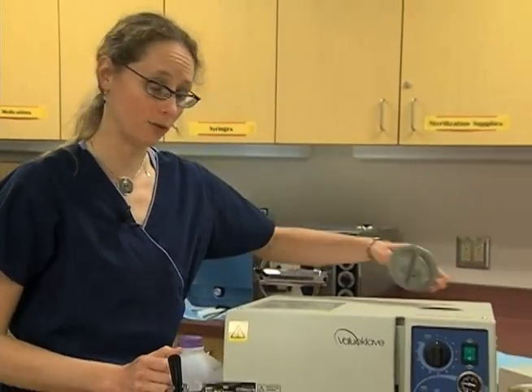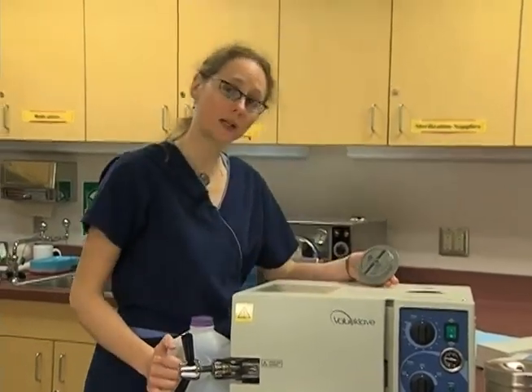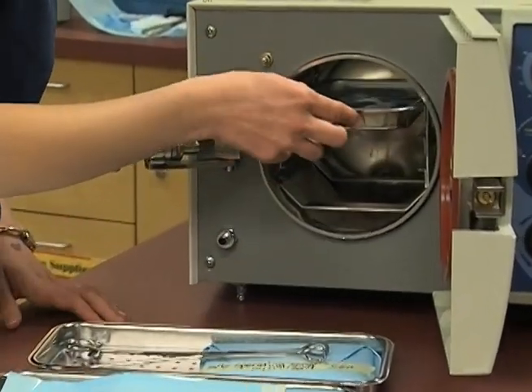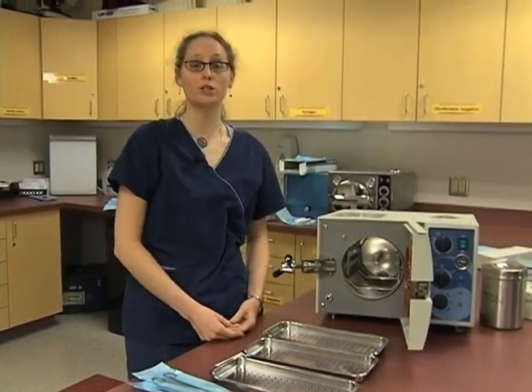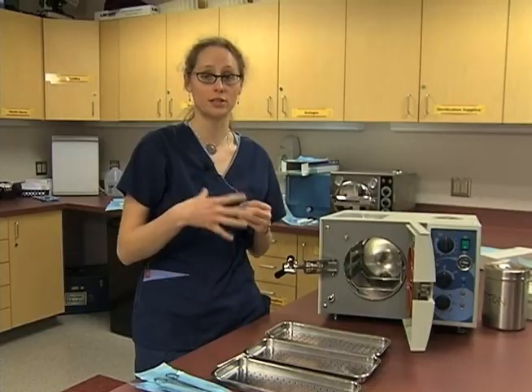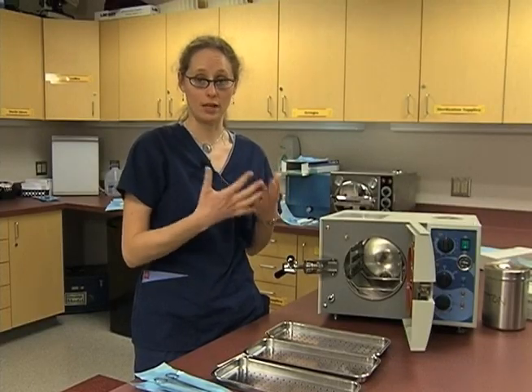Each time we go to use an autoclave, we want to check the water level and make sure that there's plenty of water in there. Once we know there's enough water, we're going to load our autoclave. Just like when we were wrapping our instruments, we want to make sure that all surfaces are going to be heated by the steam inside the autoclave — all surfaces have to be touched by that steam, so they all have to be evenly distributed.